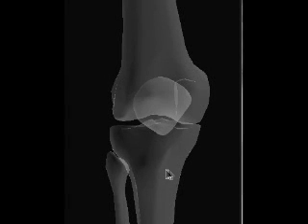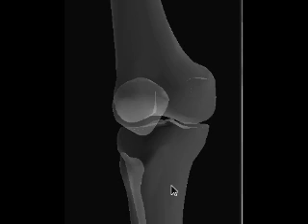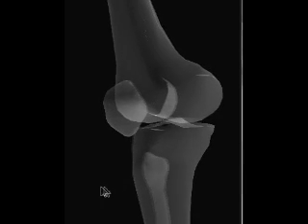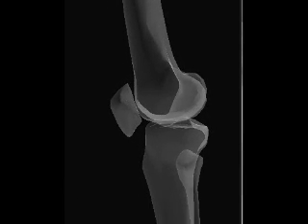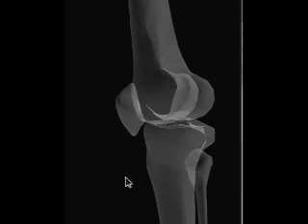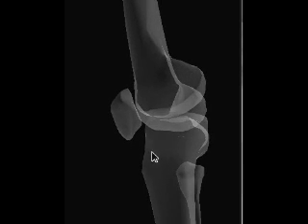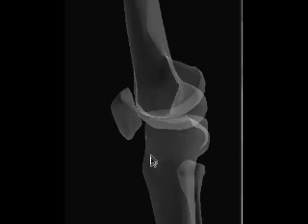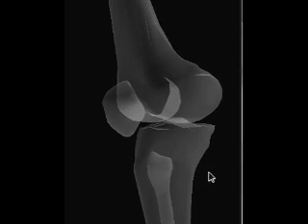In this video we're going to talk about the lateral knee. The main difficulty that I see with students trying to learn the lateral knee is not so much how to position, but rather how to tell if their film is over-rotated or under-rotated, or if they've got too much angulation or not enough angulation. So that's what we're going to talk about.